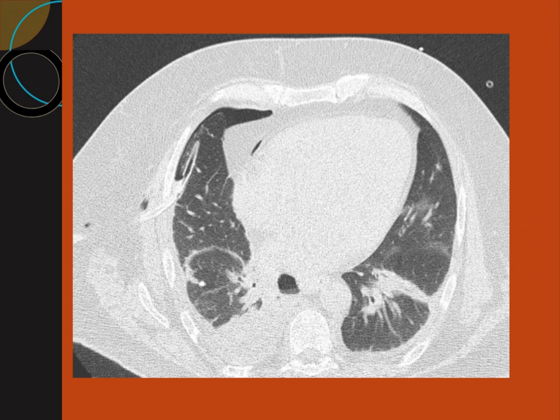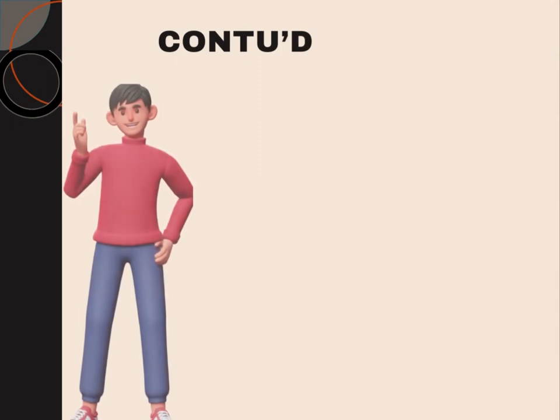But if you're feeling you need some more supervision, or you need some more technical skills to improve, then make yourself a bit more competent before intervening. So we will bring up the plan of post-procedure care. So these are very important.